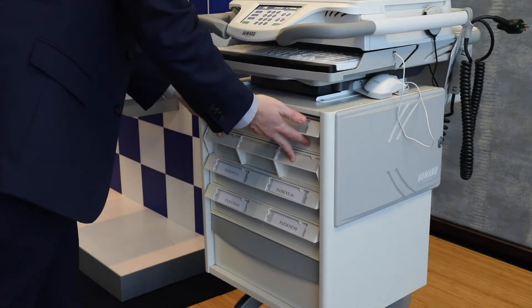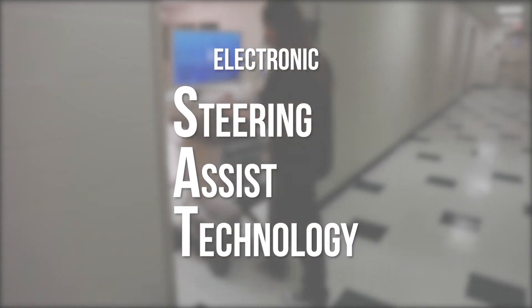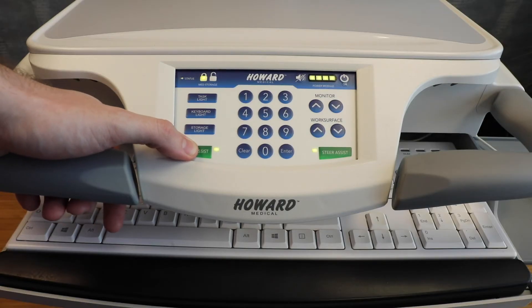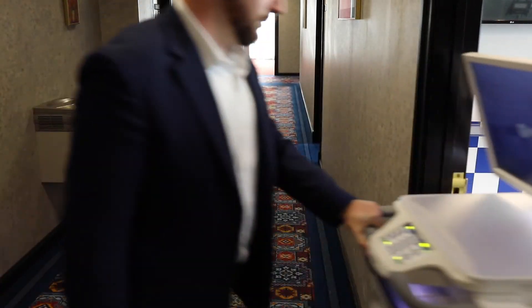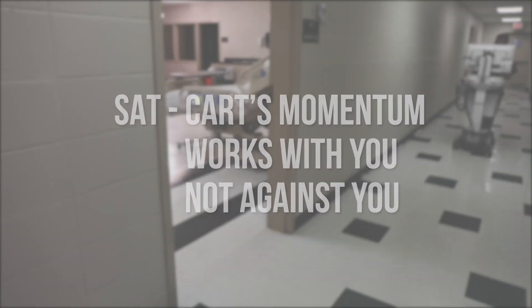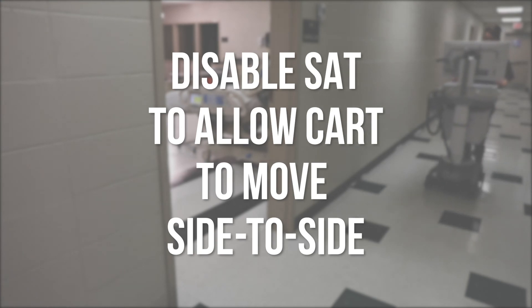Your cart may be equipped with electronic steering assist technology, or SAT, to allow the cart to take corners with ease or maintain a straight path. To activate, press the steer assist button on either the left or right bottom corner of the keypad. Once activated, the rear casters will engage, allowing the cart to move in the direction you point it. This allows the cart's momentum to work with you, not against you. You will want to disable the SAT when you arrive at your destination so that the cart can move side to side.